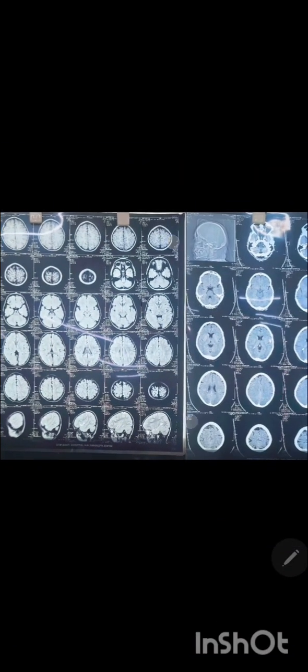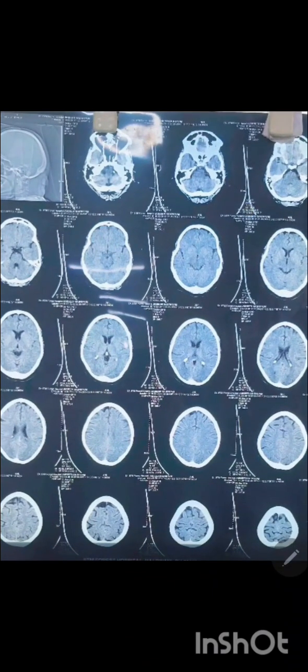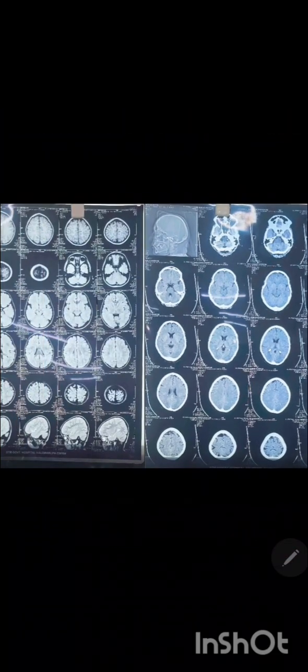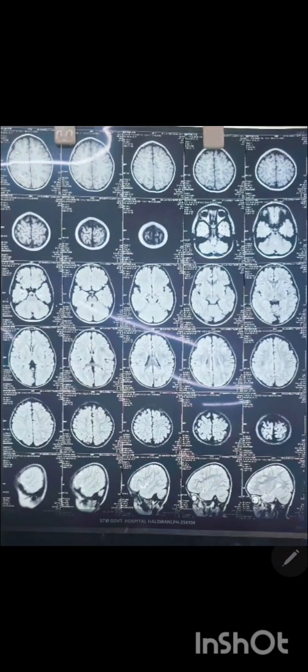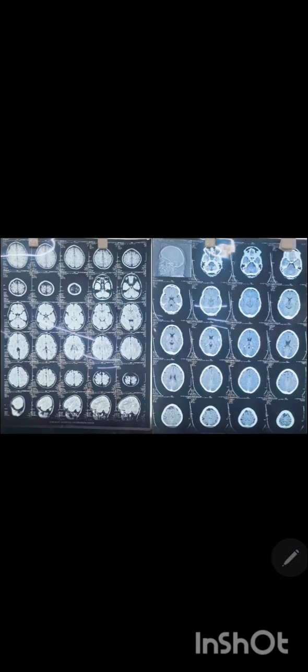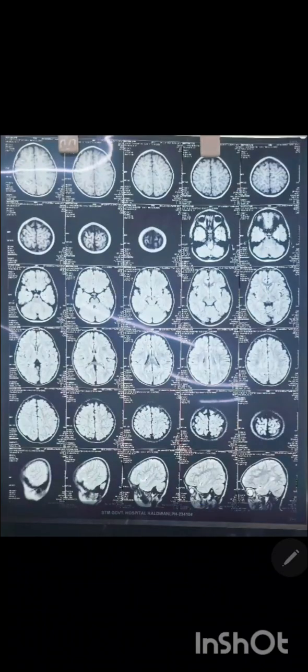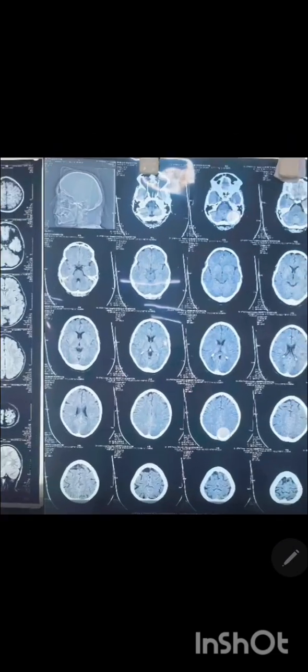On the basis of noise, during the CT scan relatively quiet noise is present, but during the MRI process it is very loud and requires ear protection in some situations. On the cost basis, the CT is $500 to $3,000, and the MRI is almost $4,000 to $5,000, meaning it is more costly in comparison to the CT.